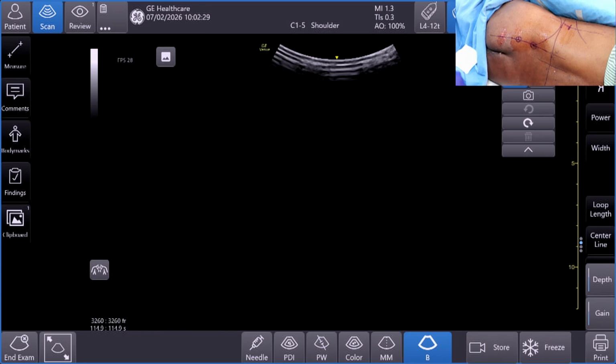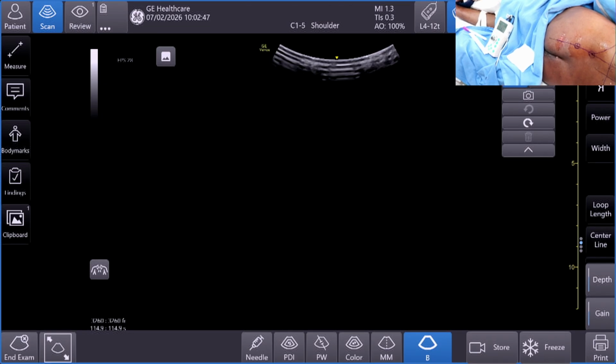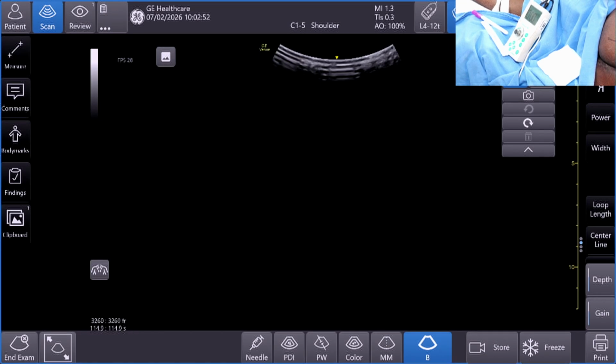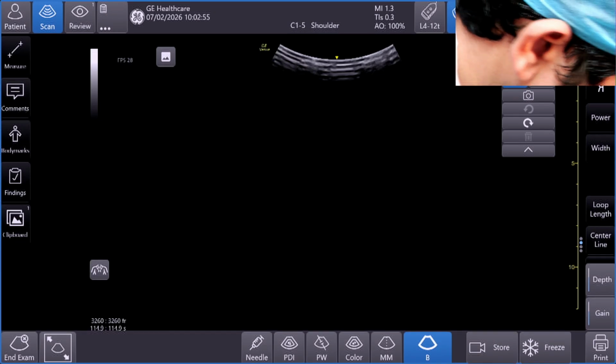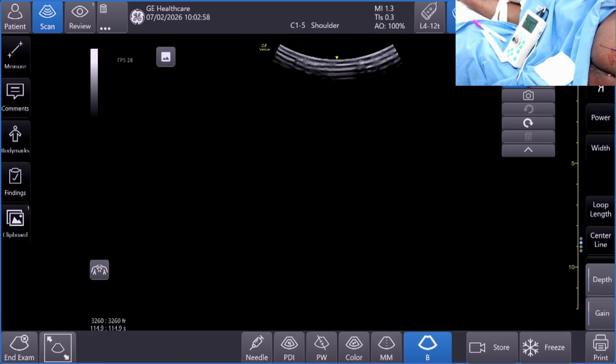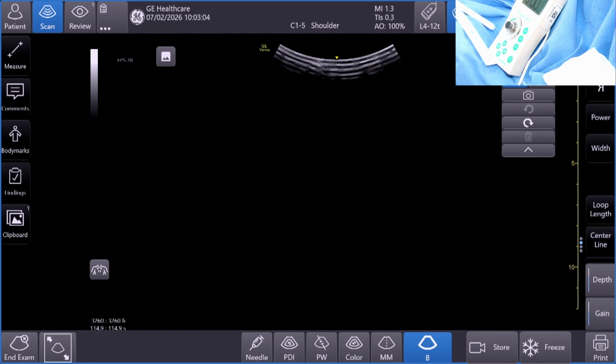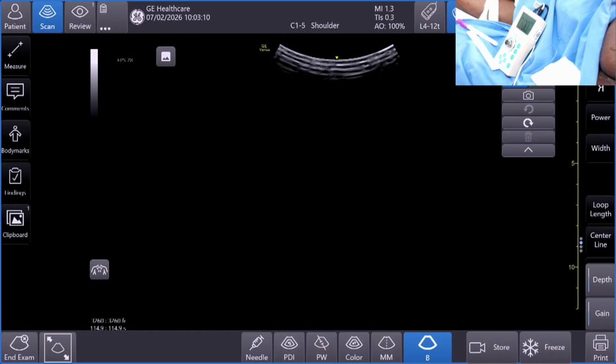So we move ahead with our block technique. This will be a neurostimulation guided block initially. If I am unable to get the contractions, then I will apply ultrasound. This is a Stimuplex DIG, a B. Braun model, and this is used for generating the current, and we usually go for 1 hertz. This is currently at 2. Can you change the preset from shoulder to lumbar or MSK if it's possible? I think that would make the images look much better.